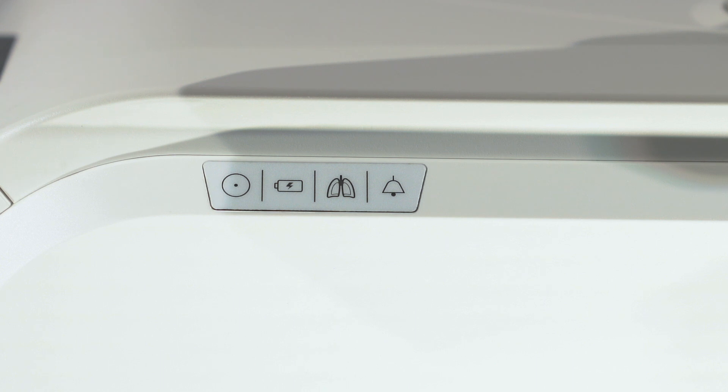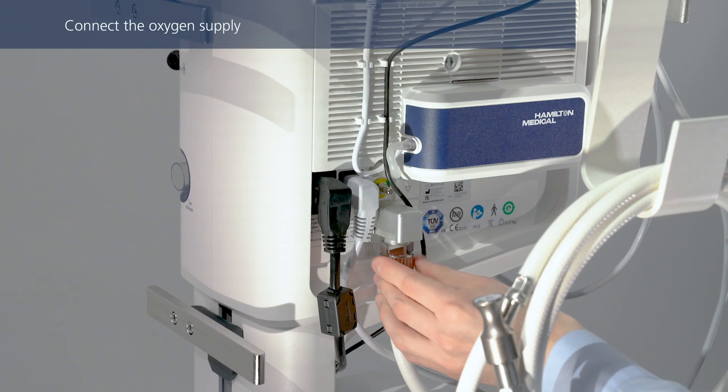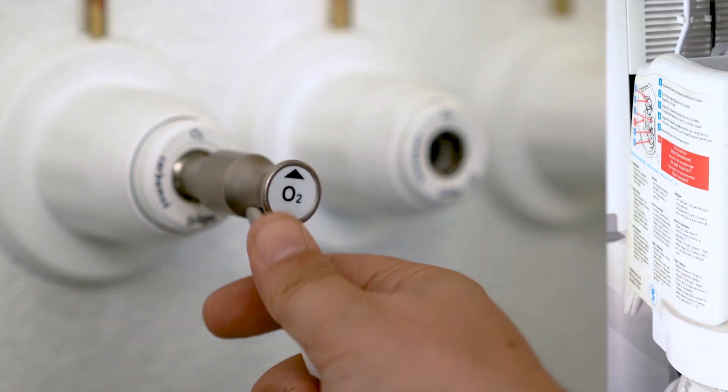Make sure the ventilator is connected to a power source prior to starting ventilation. If you haven't done so already, connect the oxygen hose to the ventilator, and then to the gas supply or a gas cylinder.